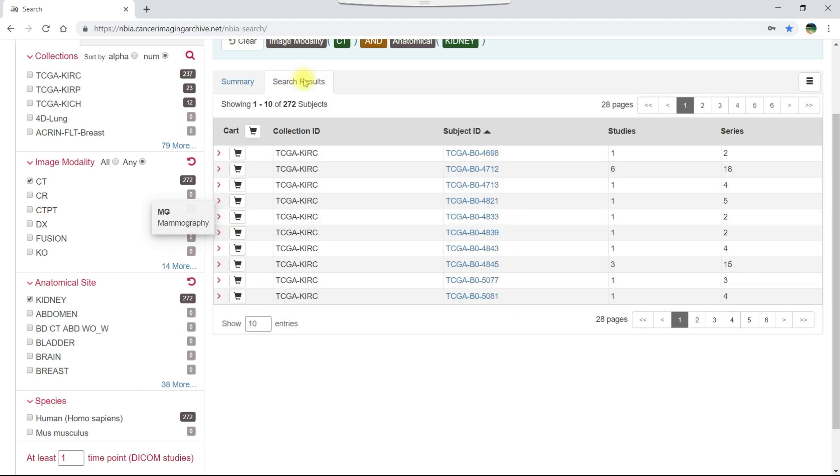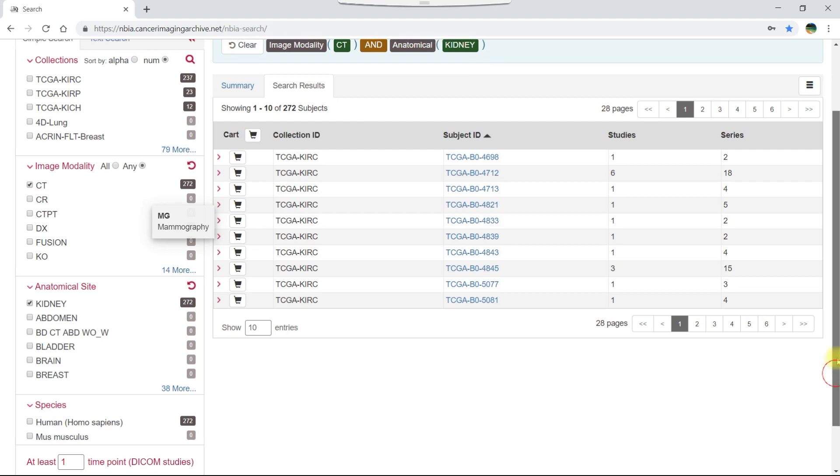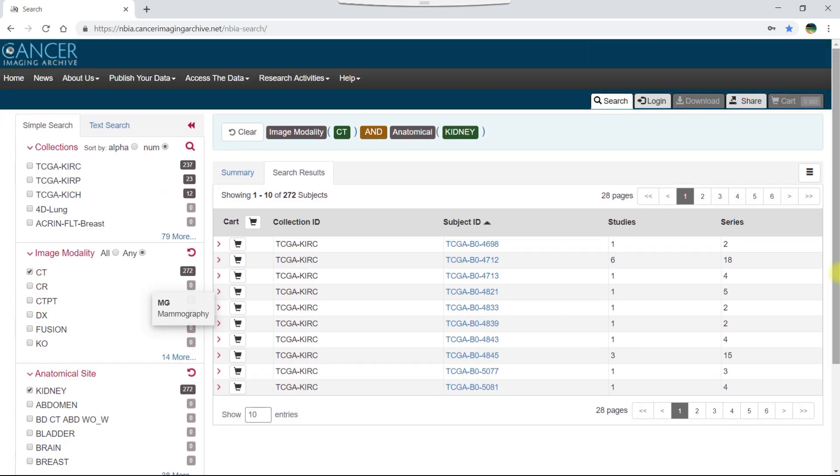Now let's click the search results tab. You can select all of the subjects on a page of the search results and add them to your cart or select only partial subjects, time points, series, or scans by drilling down into the data.